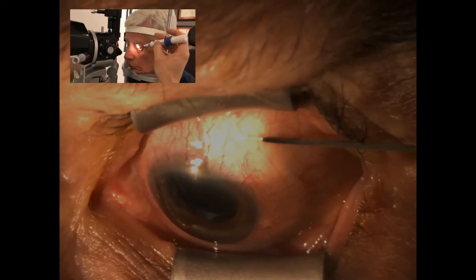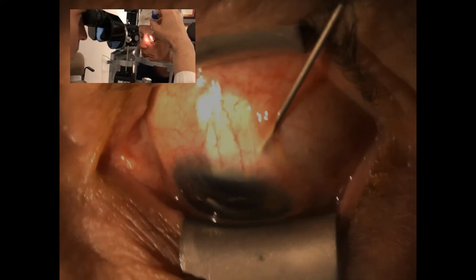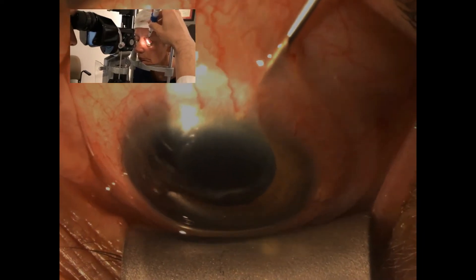Additionally, we go over the details of the slit lamp zen implantation, a technique that was pioneered by my co-author, Sebastian Gagne, an option that can be useful in the right patient.